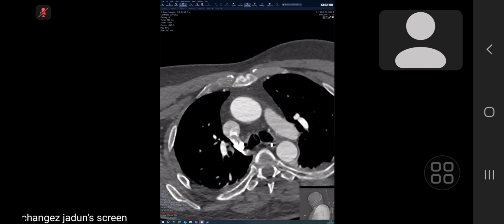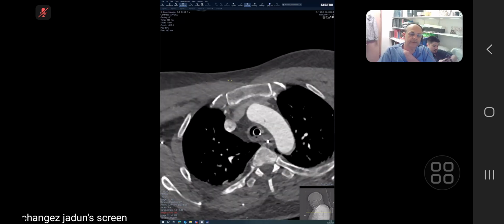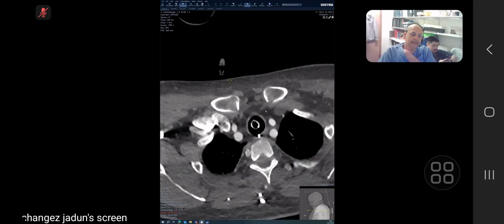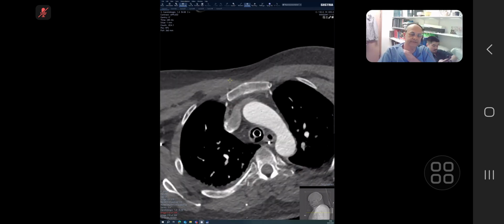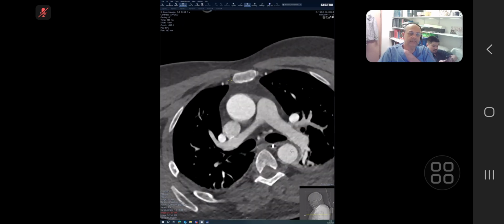So it depends upon the clinical decision. If it's within the 6 hours, then we would immediately go for the catheter angiography and would try to thrombolyze this thrombus. Okay. So here is what I would be looking at. The first thing that I look at on a CT angiogram is the aortic arch, because you can have an aortic arch dissection.